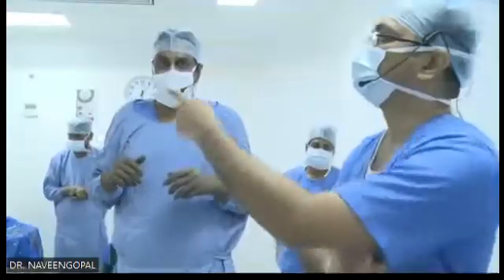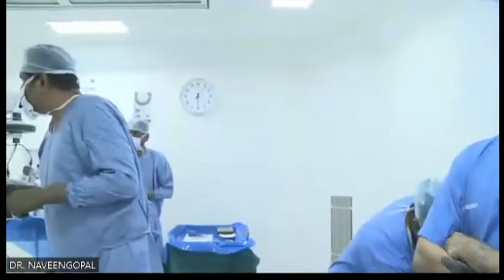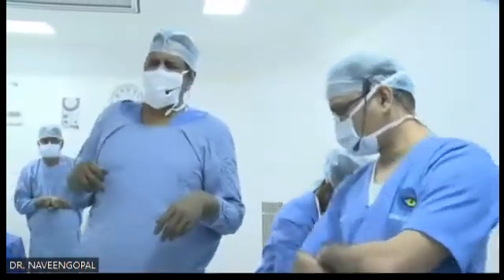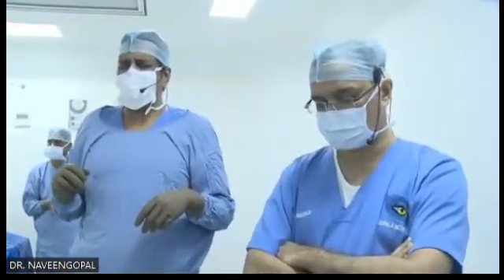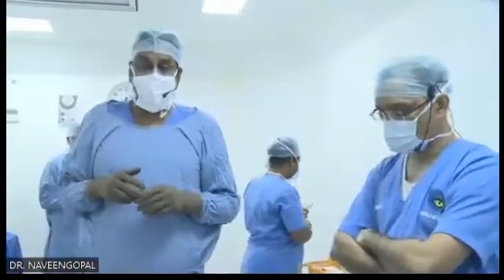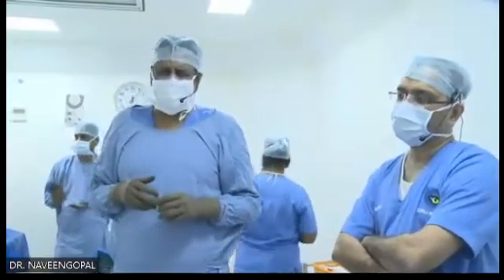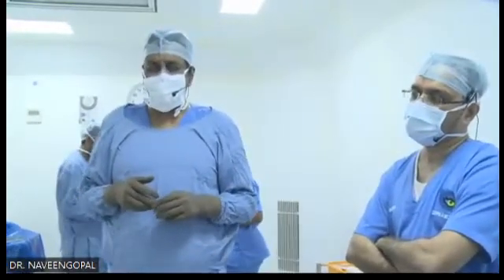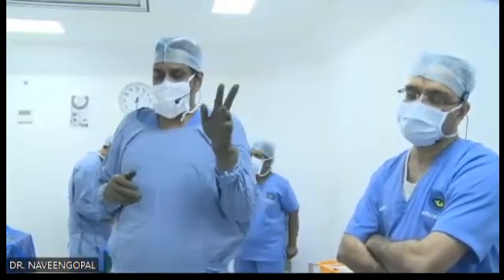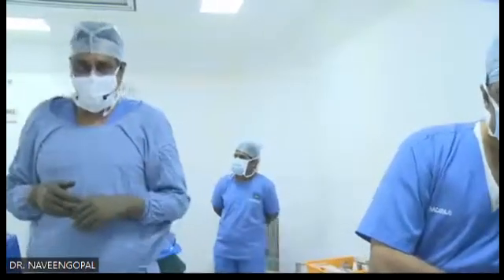What is the lowest power? The lowest power I've implanted is 3.75, I think. His cornea thickness was 450 or something. He was not at all fit for PRK, and he wanted to get rid of glasses at any cost. I think it was 3.75 in 2015. It was one of the sisters who was working in Saudi. I remember her. Yes, that is the lowest I've implanted.